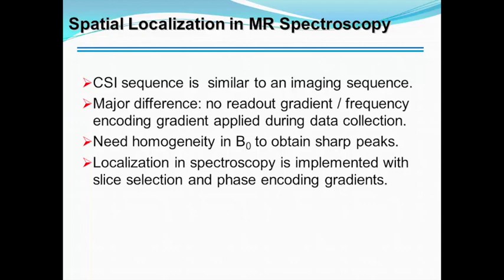So basically, no frequency encoding gradient, because we need the homogeneity to obtain the sharp peaks, right? So localization spectroscopy can only be implemented with slice selection and phase encoding.